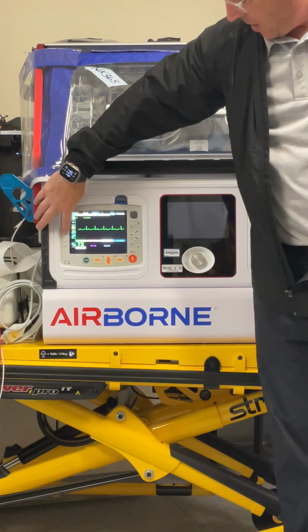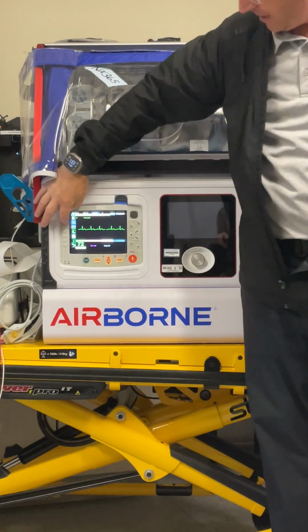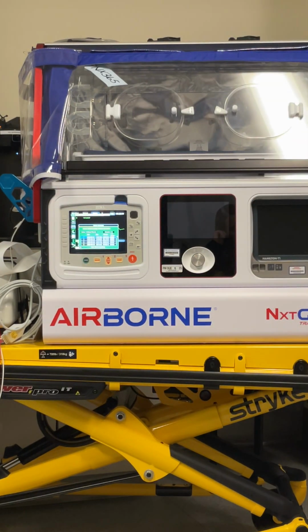Go down to log. Here's where you guys are all done with the call. You want to get data out of the device. All right. You want just your vitals. It's going to be print trends. So the second quick access key down is print trends. That is all your vital signs.